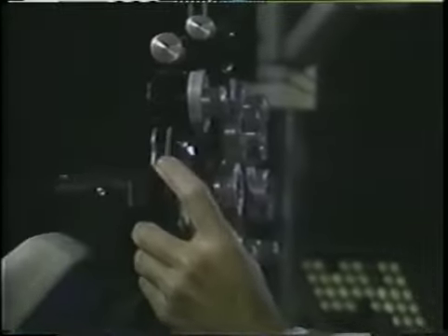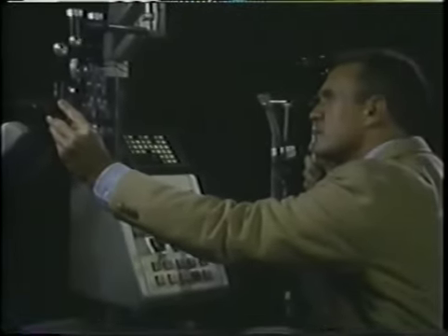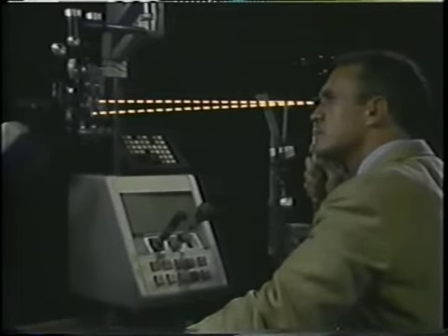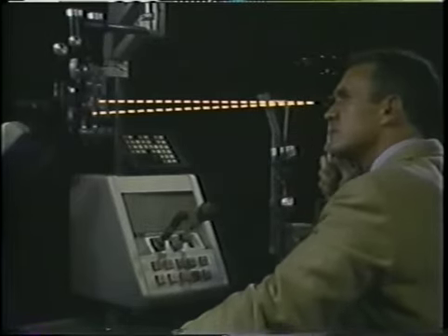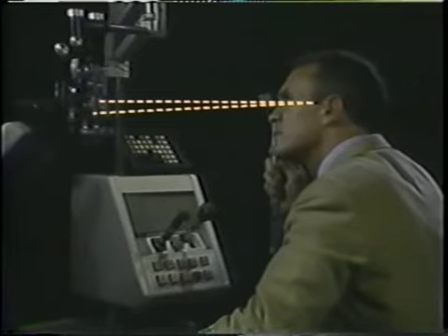So far, the examiner has remained at the normal working distance and has moved the far point about by changing the lenses in front of the eye. Once the far point is in the vicinity of the retinoscope, however, the zone of neutralization can be examined very precisely by moving forward and backward, like so. If you move forward, the far point now falls beyond the retinoscope, and you will pick up with movement. The farther forward you move, the more pronounced the with movement becomes.